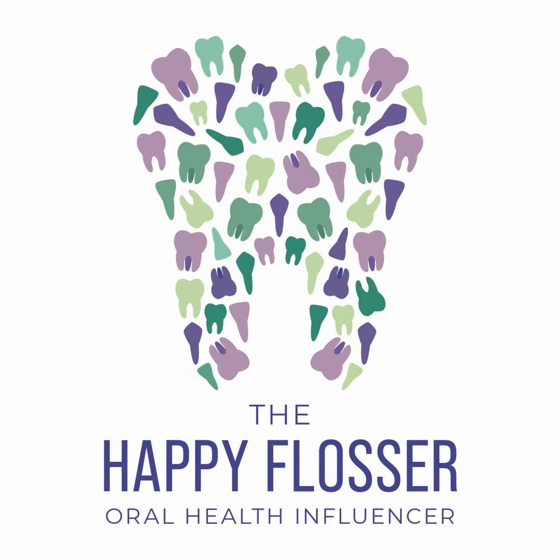Is there any widening of the periodontal ligament space? And then I'm looking at the bone levels around the teeth. What does the crestal bone look like? What does the horizontal bone look like? Are there any vertical defects? I'm looking at the support structures around the teeth. So I tend to look first at the big picture. I look at the TMJ, the mandible, the maxilla, the sinuses, and then I hone in on the teeth themselves, and then I start looking around the teeth.